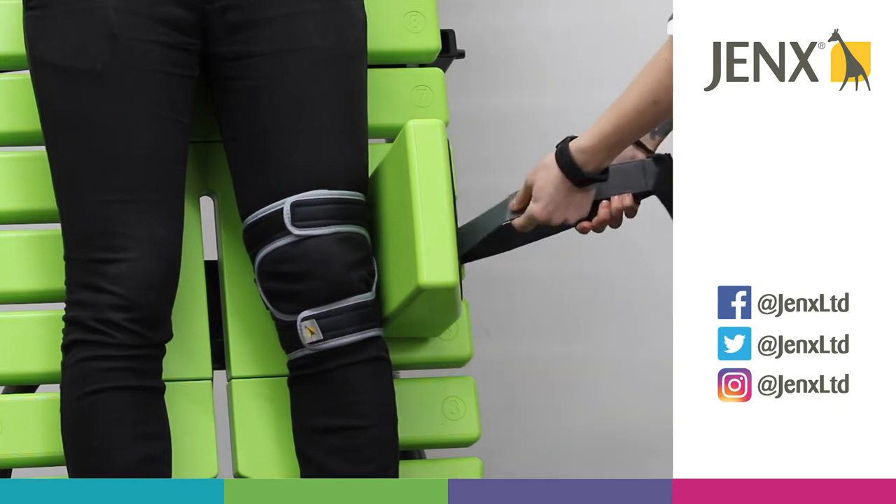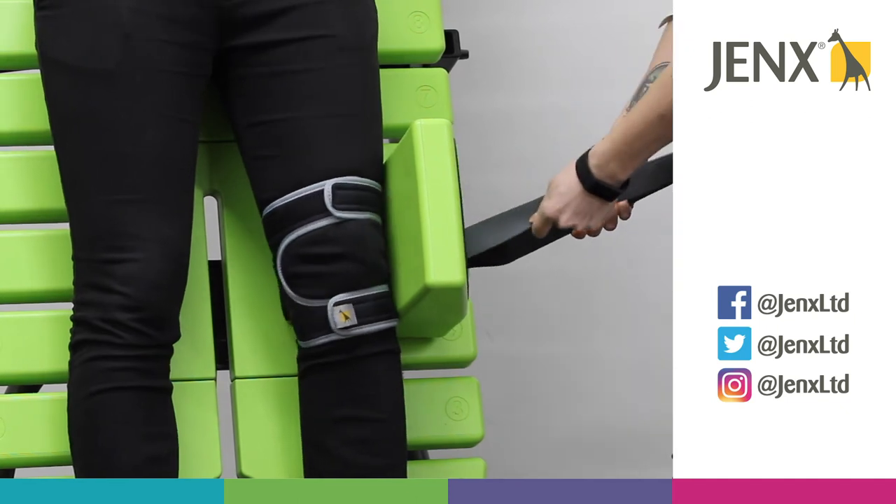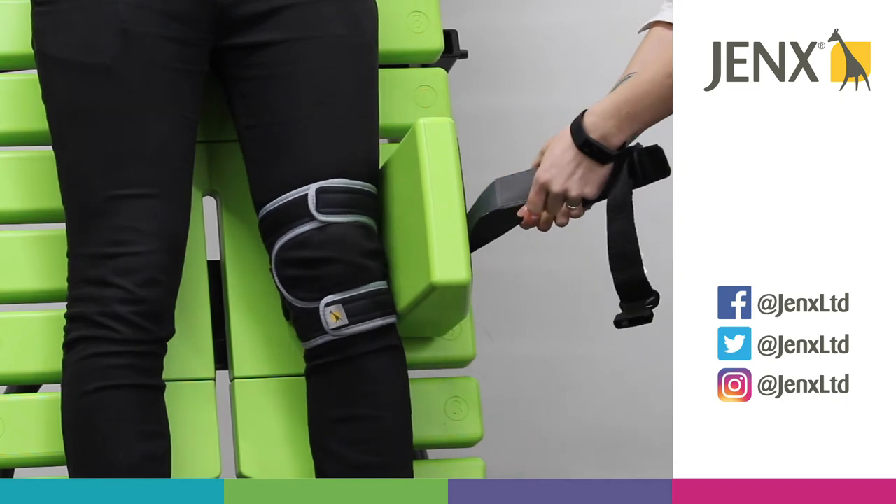If I pull the grey strap towards me you will see the knee rotate into external rotation. If I pull the black strap you will see the knee rotate internally.